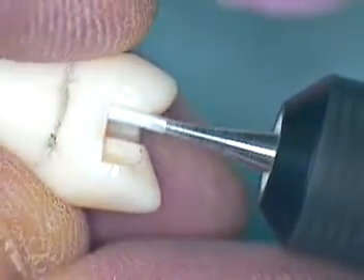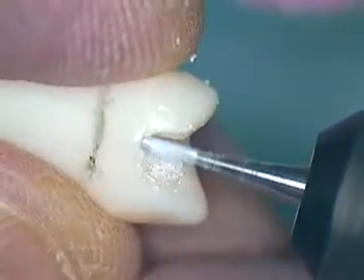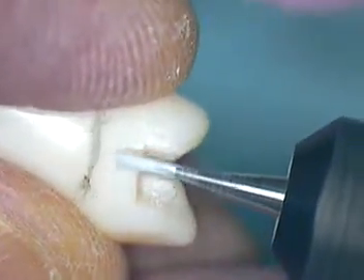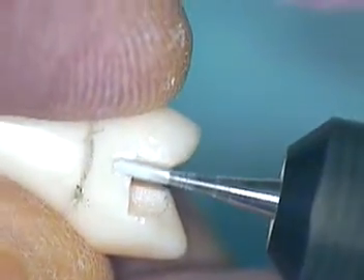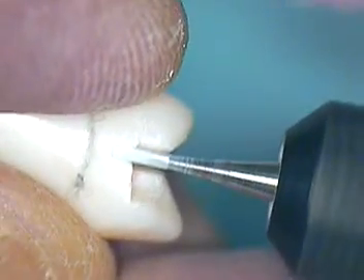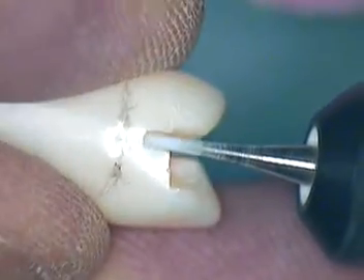I'll start here and just go in straight. You can do this with the 699s — that would be okay. I'm going to go right to my 556. We can probably take that down to right about here. Our depth needs to be equivalent to that of the occlusal, so I think we can go a little bit further.